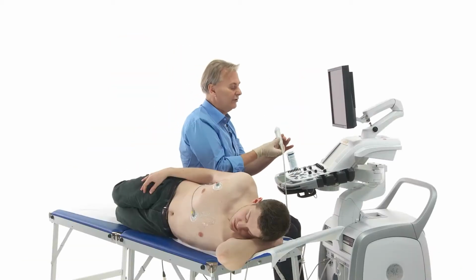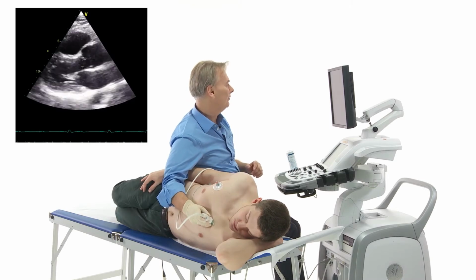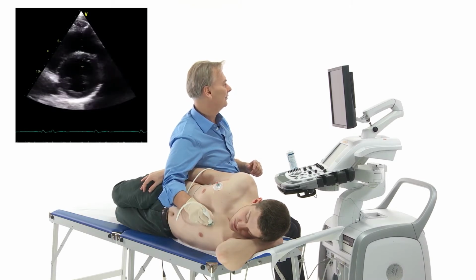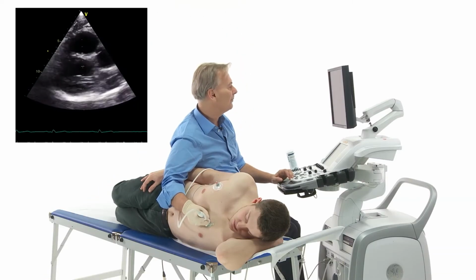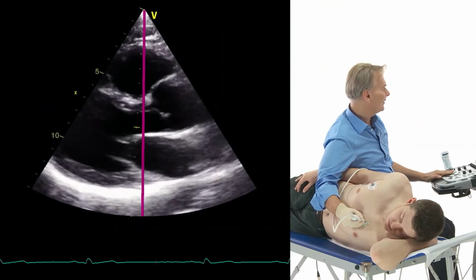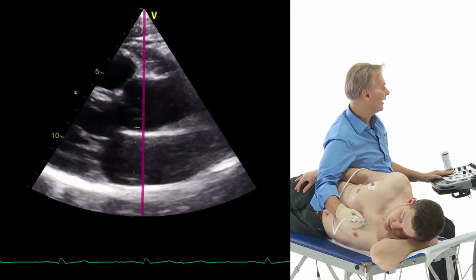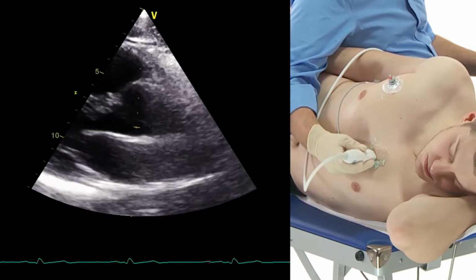We already showed you some parasternal views. We showed you this view, and this view. How are these views actually connected? Well, let's start out with the parasternal long axis view to give you a better understanding. Okay, this is the parasternal long axis view, and now this here would be the midline of the sector. Let's bring the aortic valve now into the midline, and then we start to rotate clockwise.